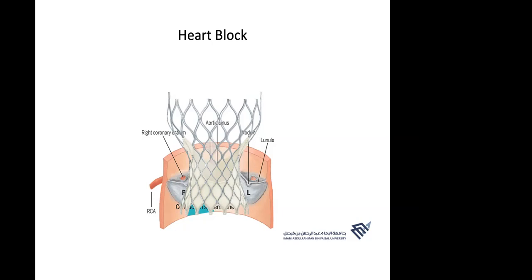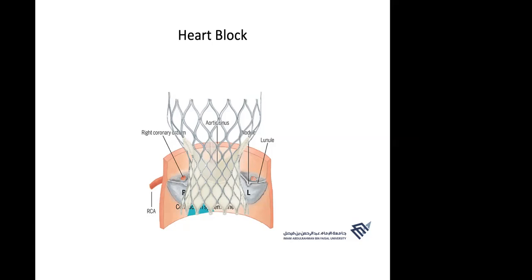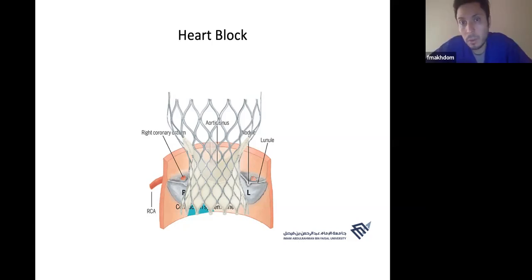It has nothing to do with keeping the valve, because in TAVI we are not removing the calcium and the valve, so it will not... Would progression of disease cause more heart block over 2 or 3 years after TAVI? Maybe, I don't know, maybe.